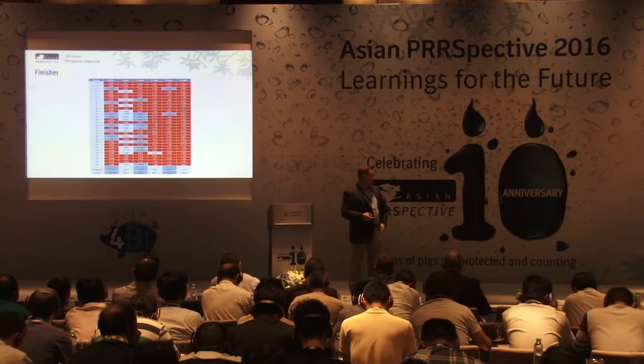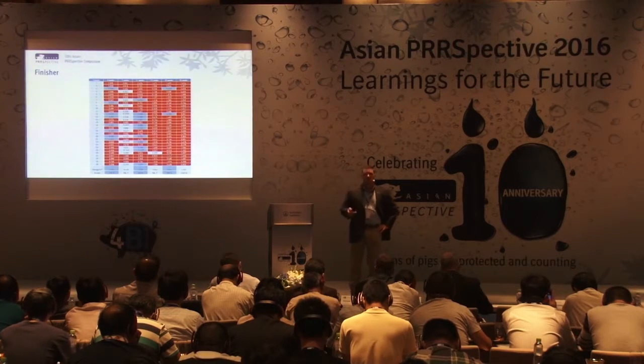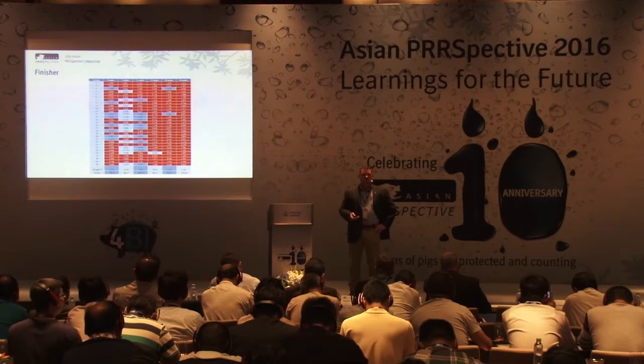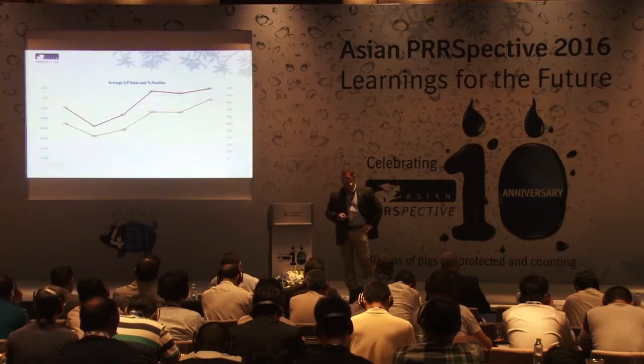I'm going to argue that we can't tell a lot from this data. There's so many other factors that go on. In order to make sense of this data, we really need to add another test. And again, that would be a PCR.